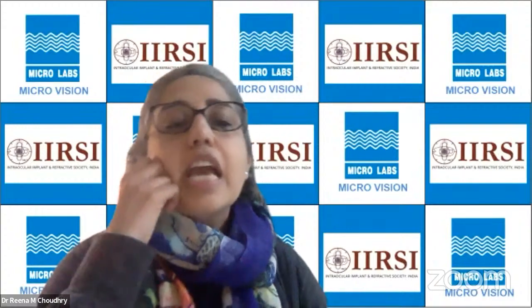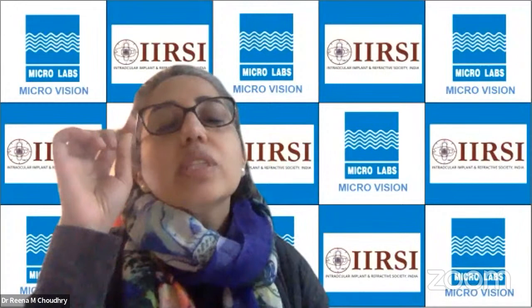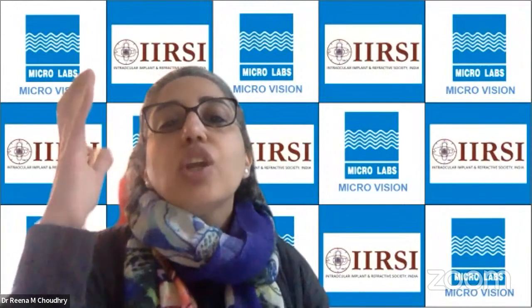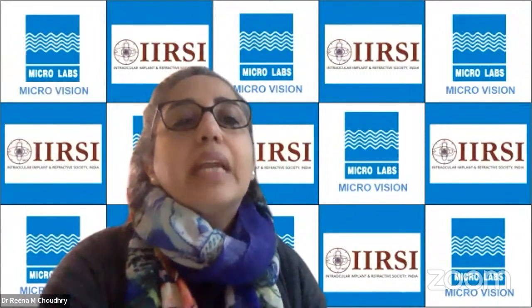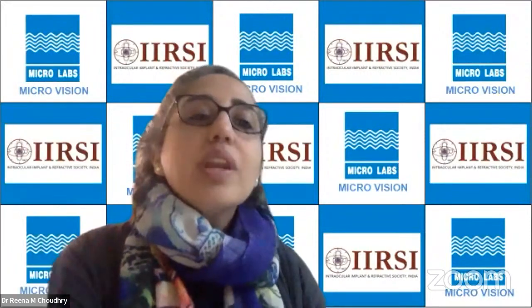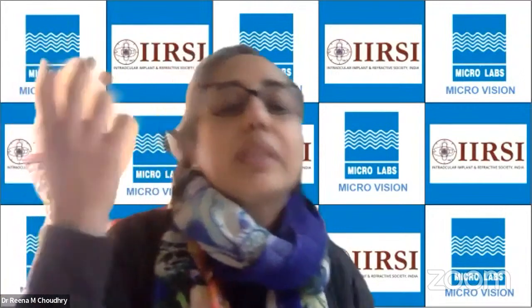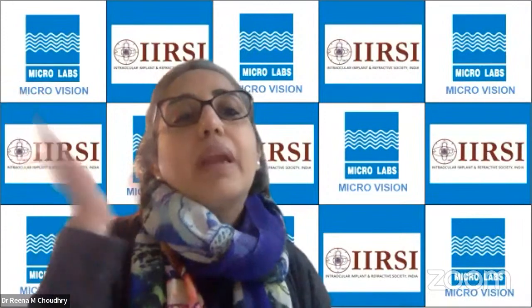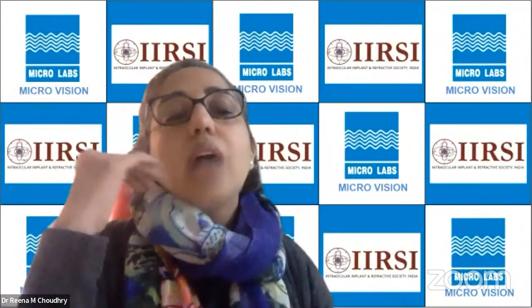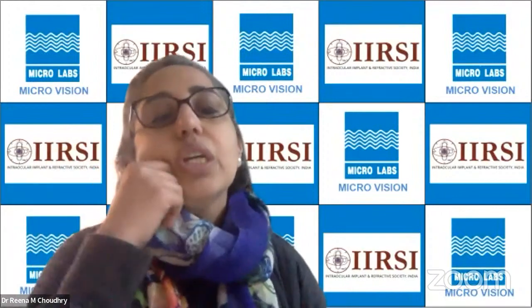And before that, if my blebs are not filtering and the pressures are very high, sometimes I give just a little massage to see if there's anything occluding, and it goes away, and then usually the blebs form and they maintain decent pressure. But if they don't, and the pressures are really 28, 30 or something, that's the only situation where I might release early. Otherwise, after 2 weeks, depending upon what the pressures are, how is the height of the bleb, how much filtration you can see, and how much vascularization is going on.